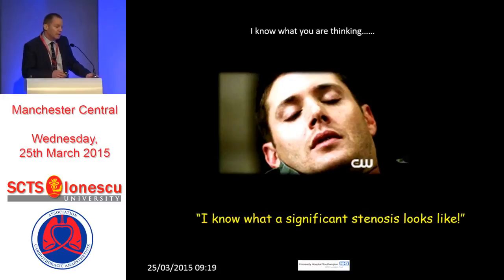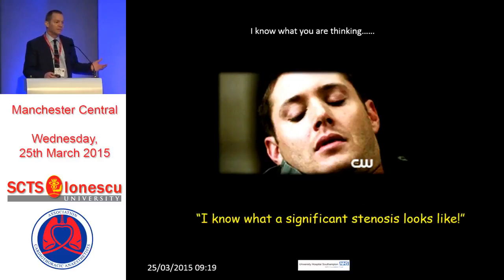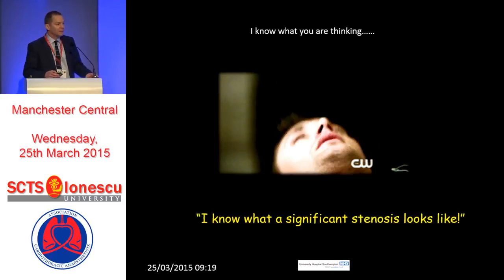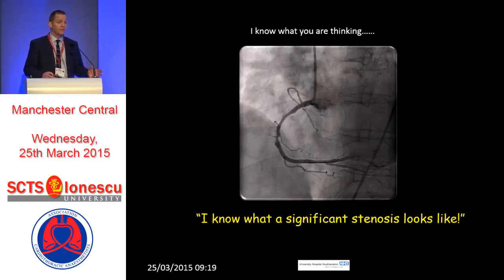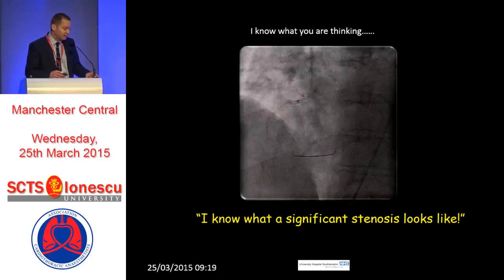I know what you're thinking. You're thinking, I know what a significant stenosis looks like. I don't need some cardiologist to come up from Southampton to tell me. And I can understand why you think that, but the fact is that you're wrong. If one thing comes out of this presentation, I want to convince you that you can't tell whether a stenosis is significant by looking at an angiogram.